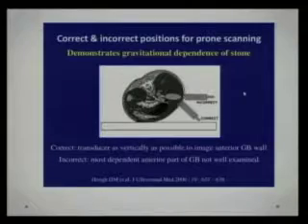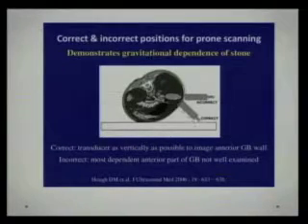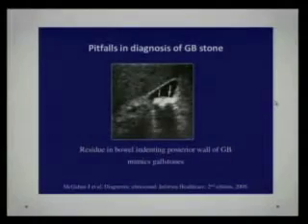When the patient is supine, they fall towards the posterior wall. So our objective is not to identify the gallbladder fundus, which we are doing here, but to identify the anterior wall of the gallbladder, because the stones are along the anterior wall now, and the distance from the probe is the shortest when you insonate it this way. Is that clear? All right.